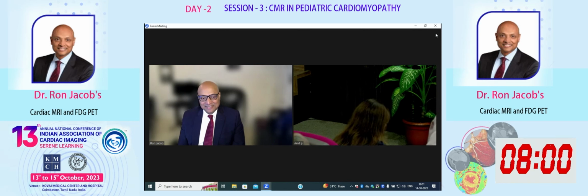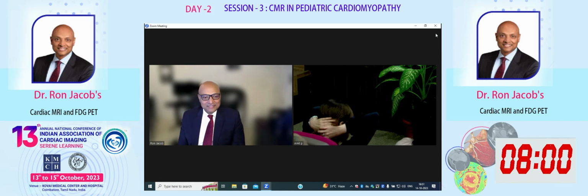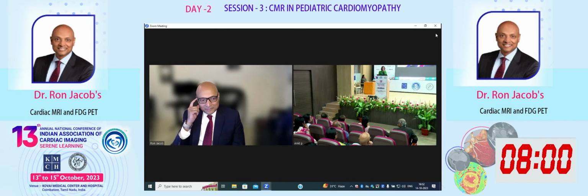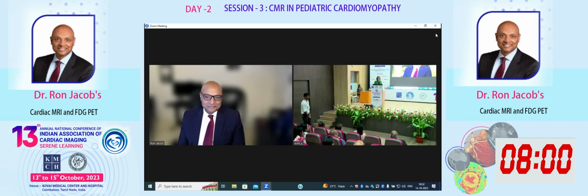There's another question by Dr. Priya. Not exactly a question, because I also had a talk earlier in the day on this, and I was going through the updated literature. Like Dr. Ron said, I think the advantage of FDG PET is when you have a strong clinical suspicion and your cardiac MR is negative. We say cardiac MR is to rule out cardiac sarcoid. It's almost 100% sensitive. But in extracardiac sarcoid, FDG PET has an advantage of showing that extracardiac sarcoid can help you clinch the diagnosis when you have a strong clinical suspicion and a negative cardiac MR.